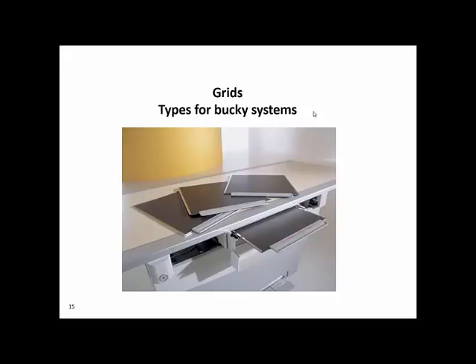In DR technology, this grid on our Bucky TH table, for example, is oscillating, and on other systems we have non-oscillating grids, because sometimes the space in the room for oscillating mechanics is not available or difficult to implement. Those grids that are not oscillating, in these cases the grid lines are removed by software in our DR technology. Oscillating grids can be low frequency grids, and because the grid is moving during the examination, the grid lines are not visible.